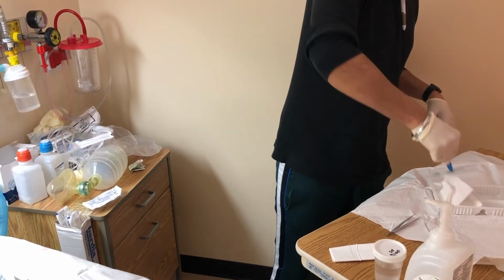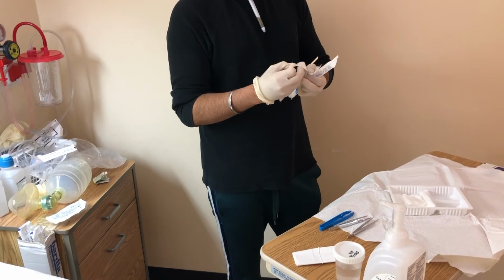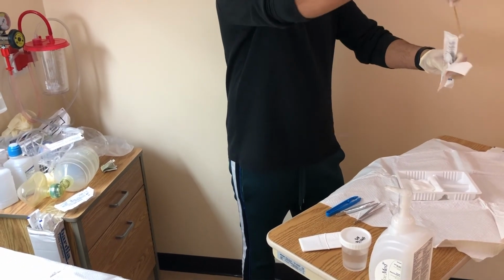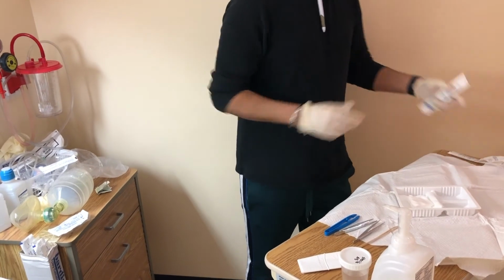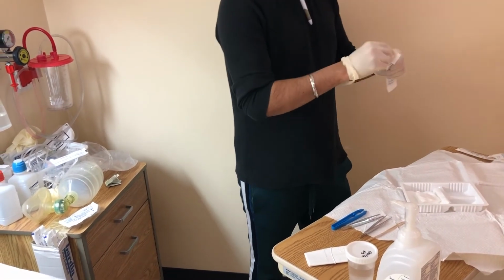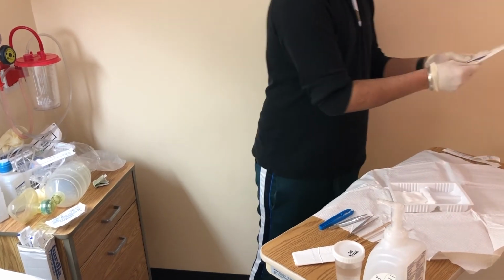Push this to the side. Like here, I don't want to put in my swabs, so we can open it up over top of this, pull it out like this. Put it there. Got about 3 minutes. Some of these, as well as this.